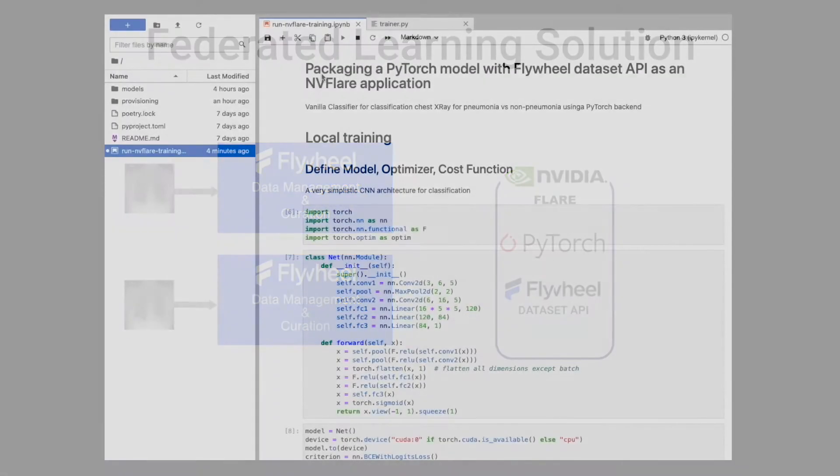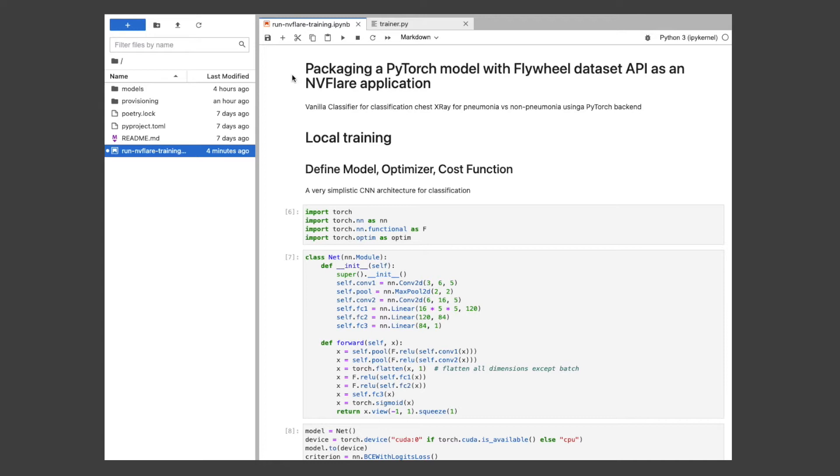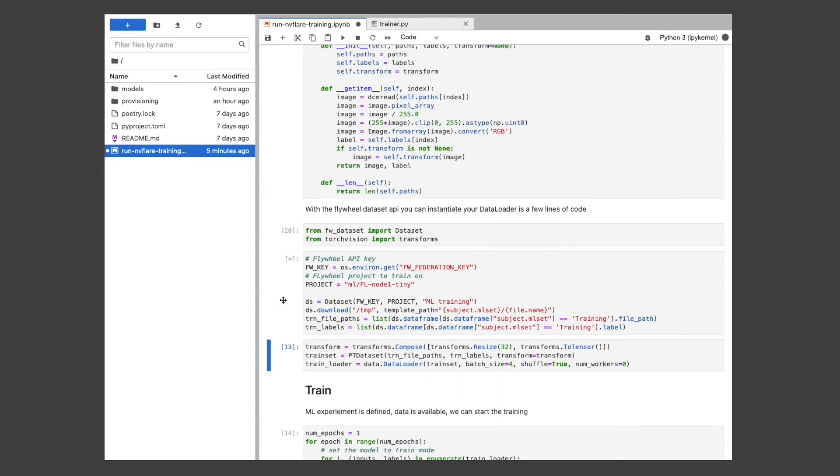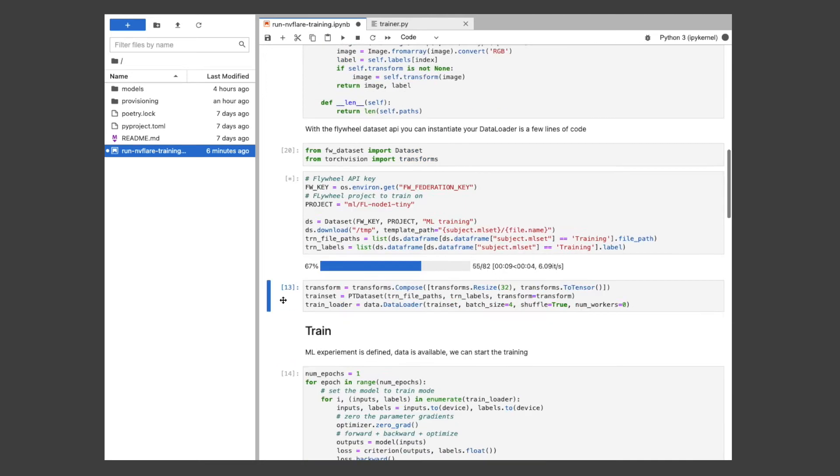This notebook shows how relatively easy it was for our solutions team to package our PyTorch model and dataset API into a Flare client application. We started by running a training experiment locally. First, we define our PyTorch model and how the training will be carried out. Next, we defined our PyTorch dataset. Then using the Flywheel dataset API with just a few lines of code, we're able to download our data in a structure compatible with our model.